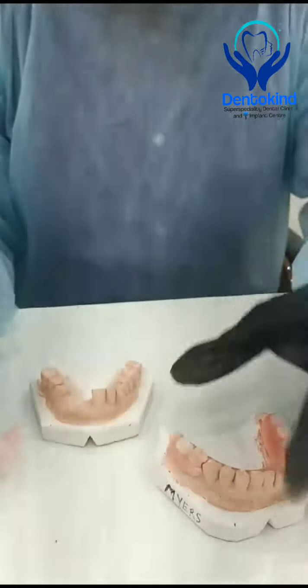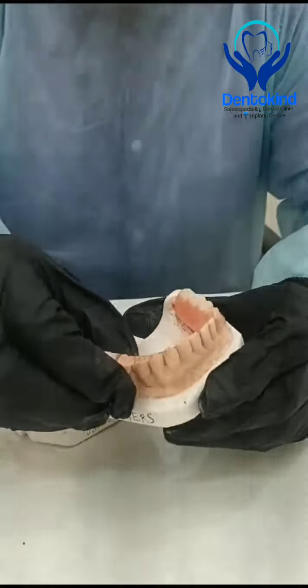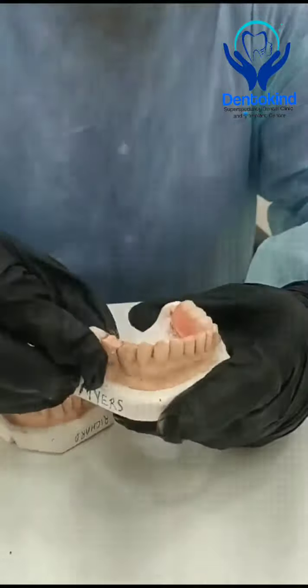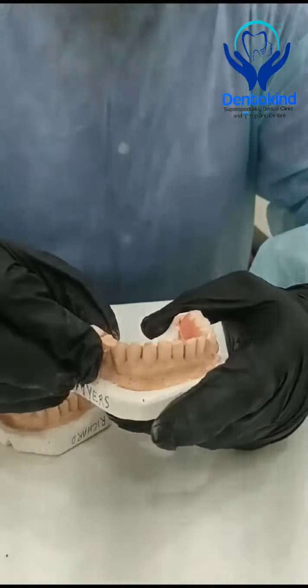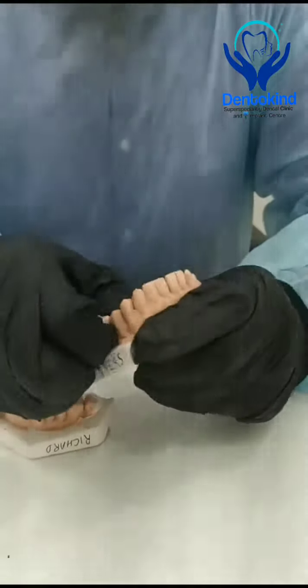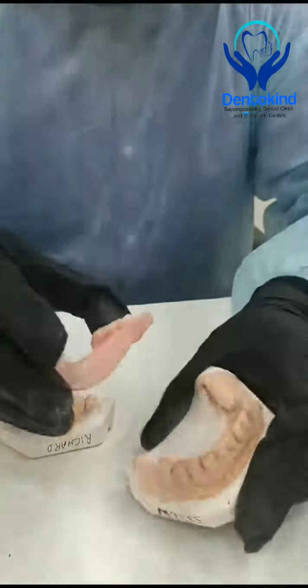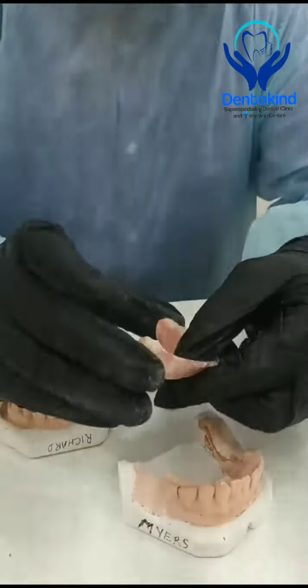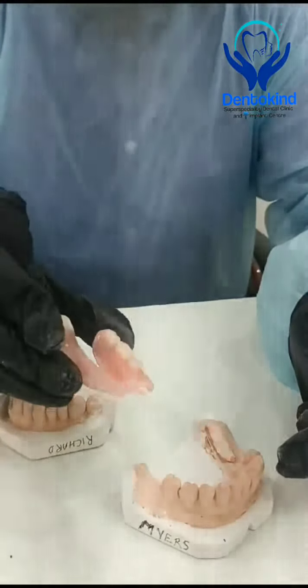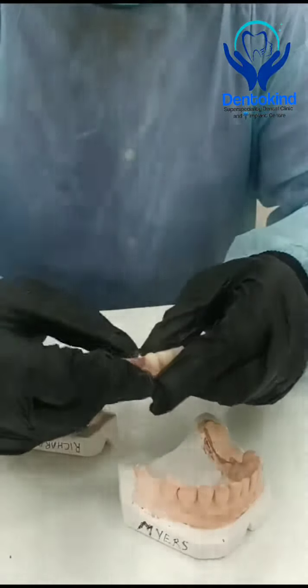This is for the lower arch. They had missing posterior teeth on both sides — one unit missing on the right side and three units missing on the left side. We have made a bilateral flexible flipper for them. This is a flexible flipper, and the clasp bar is also flexible.